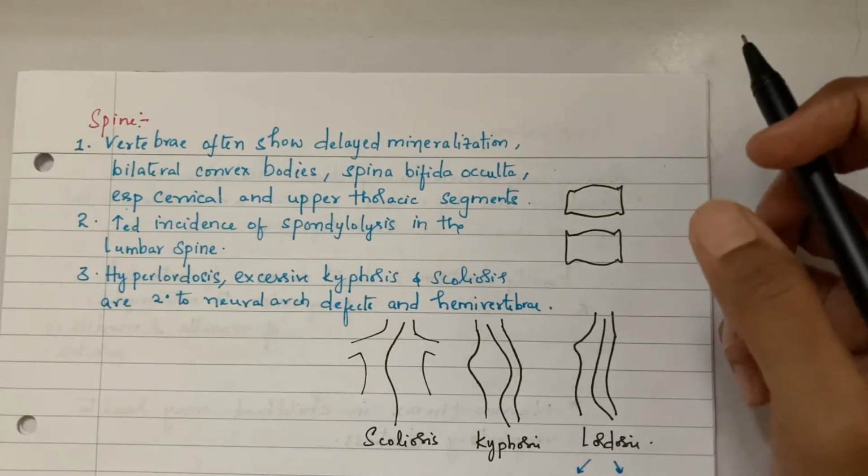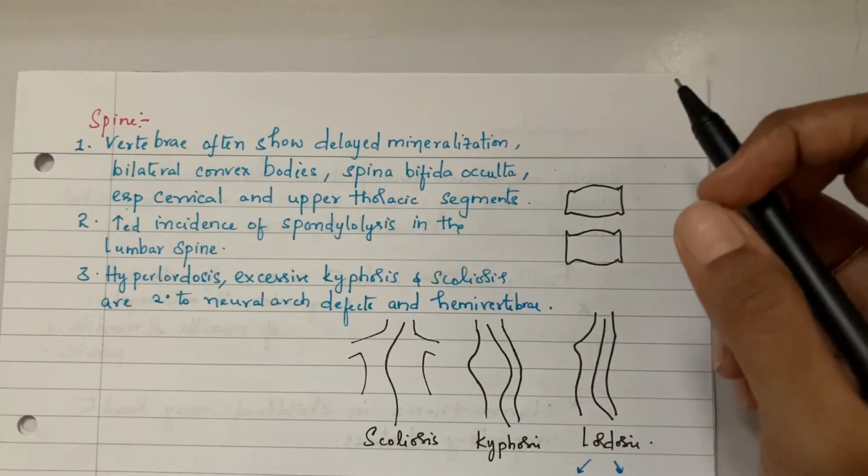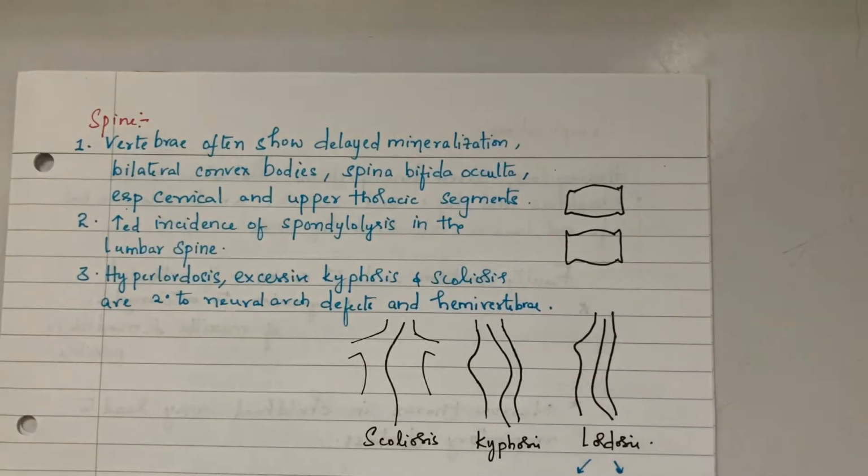So they may give a long case or short case where they give multiple x-rays. In the chest x-ray, look for the clavicle. In the pelvic x-ray, look for pubic diastasis, coxa vara, and how the femoral head is present. In the spine, what do you see? Look for spina bifida occulta, and how the vertebral bodies are. And in skull x-rays, look for the Wormian bones.